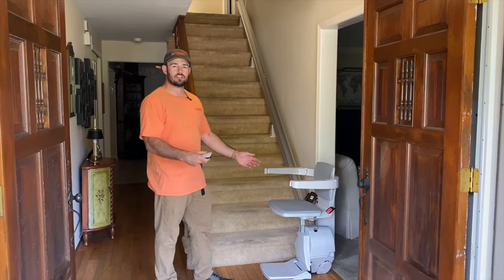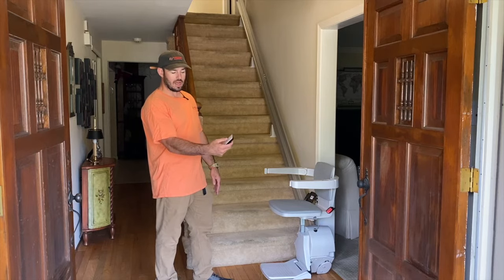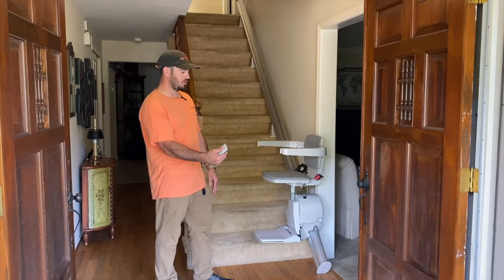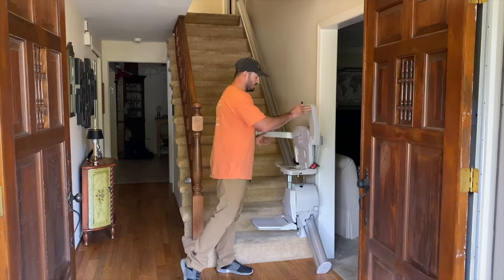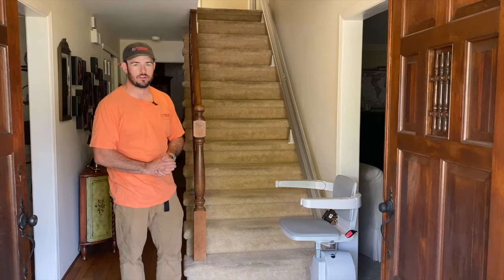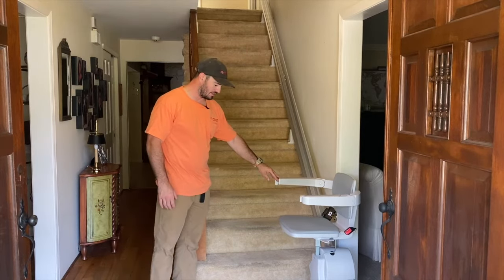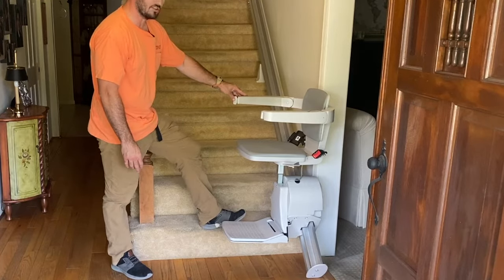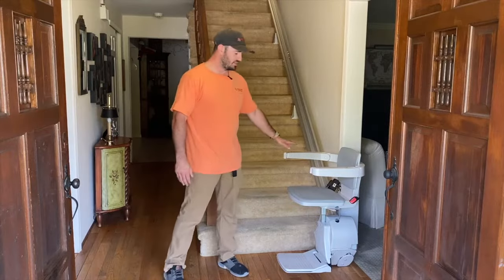Here we have the stair lift in the down position. With the use of the wireless remote, I can control the stair lift without sitting in it or using the hand control on the arm. These remotes also work with the stair lift folded up. One of the other safety features of the Bruno Elan SRE-3050 is a safety sensor in the footrest — if somebody's foot or an object were to get caught under the footrest, the stair lift will not run until the obstruction is moved.